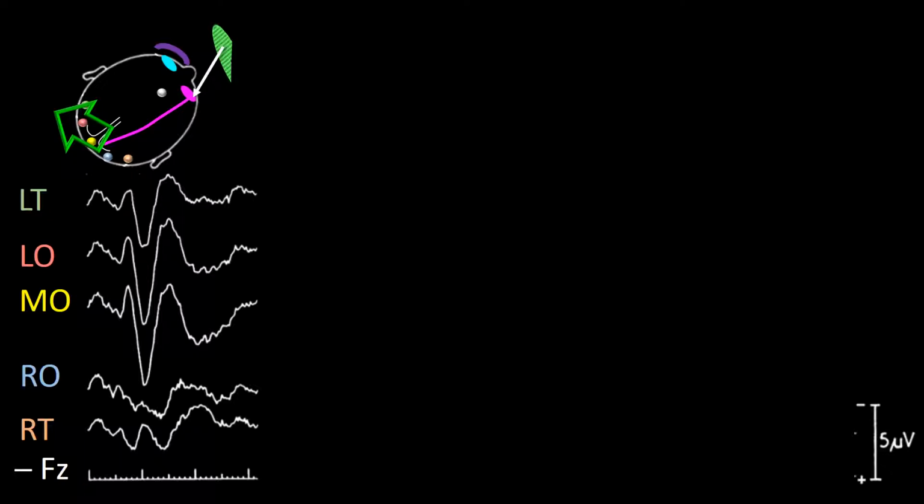The activation and processing of the stimulus at the right occipital visual cortex produces several fields at different times, each with a vector towards the mid-occipital and left occipital regions, which I have highlighted in this frame.